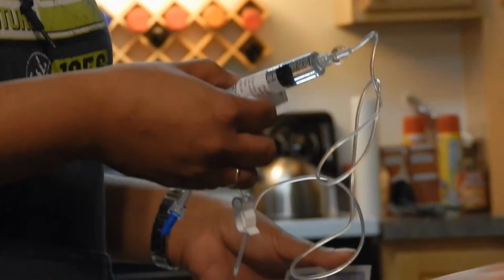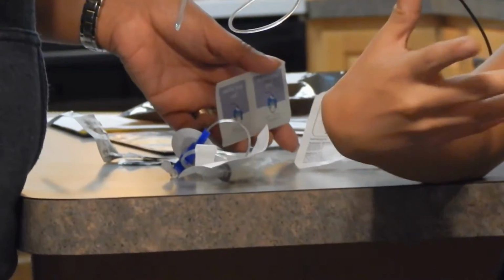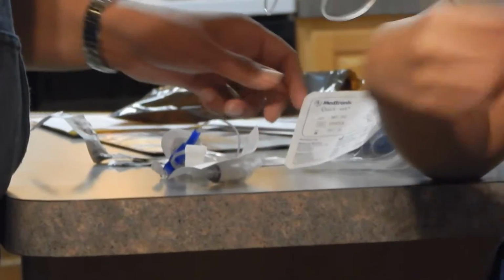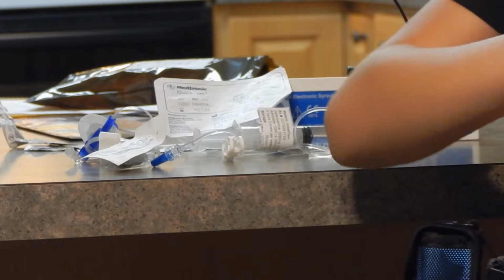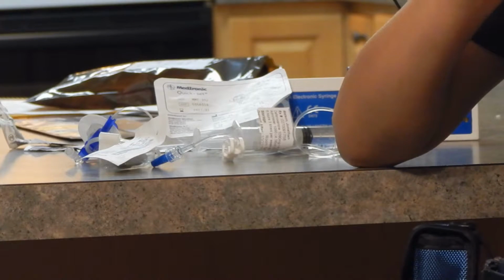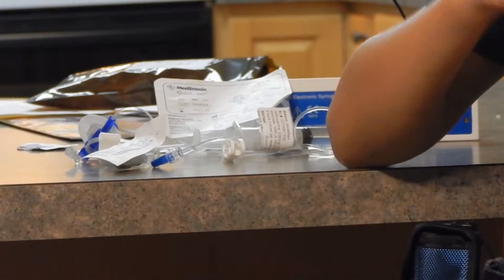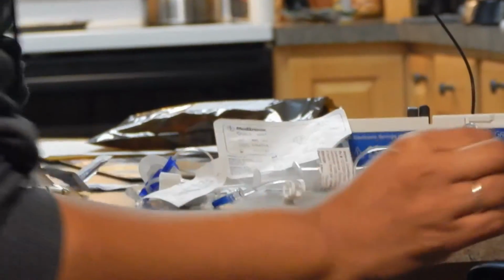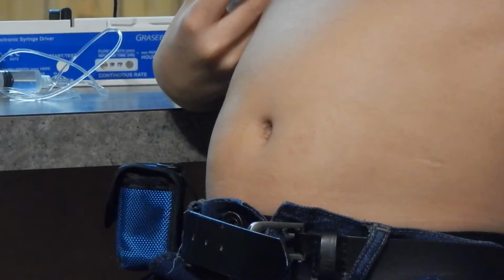So we first put Emla cream, as you saw with the white stuff, to numb the area, so that it wouldn't hurt at all when I get injected. But you need to leave the Emla cream for about 45 minutes or an hour, or more than an hour. I like to do more than an hour, because then it gets super duper numb, as I like to say. And so Mommy is going to get an alcohol prep pad and clean the area for 15 seconds. And we had to wait a little bit to dry.